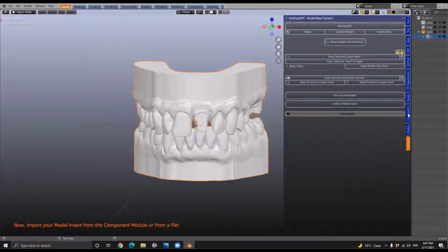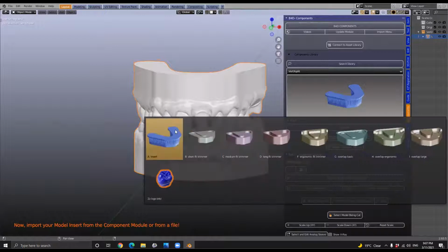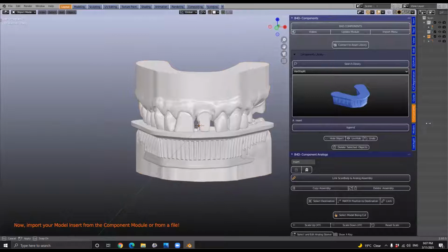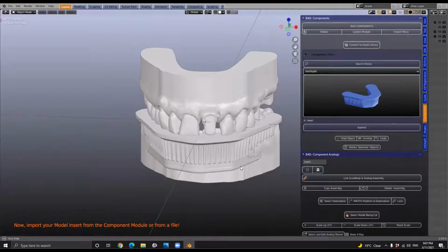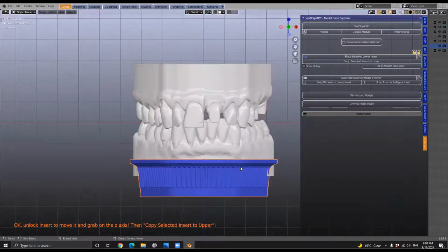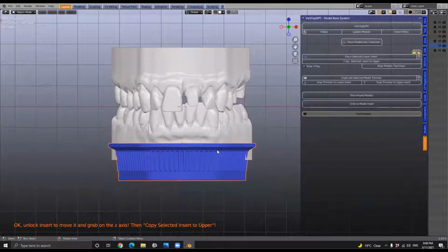So we're going to go into the components module, and we're going to choose the insert, and we're going to append that into the center of Blender. Now that goes straight into the center of the model. And what we're going to do from there is select this one and click on this place selected lower insert. When we push that one, it brings it into a certain position, and we can see it from the front view. So Wolf, just explain to us why we're putting it to that specific location.